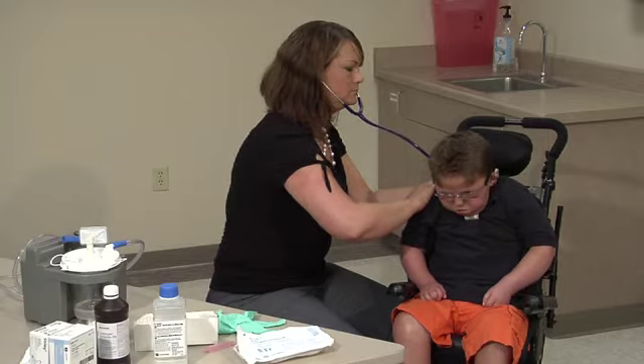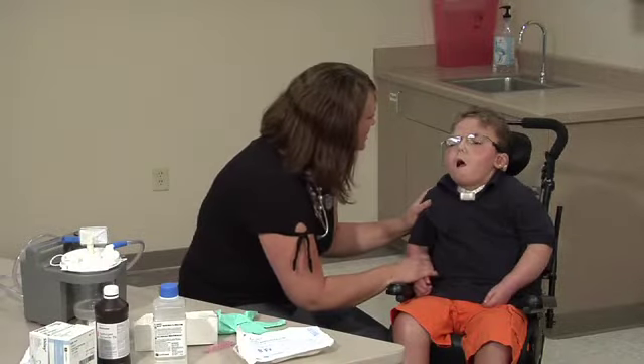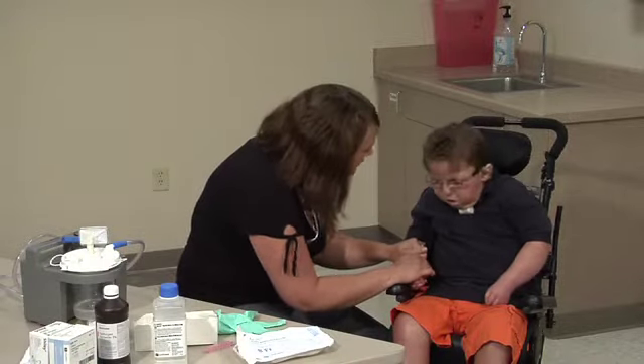Given the urgency and needs of the student, position the student to provide for the most privacy. Students in wheelchairs or other supportive seating devices can remain sitting upright or reclined up to but not exceeding 45 degrees. Explain the procedure to the student at a level the student understands.